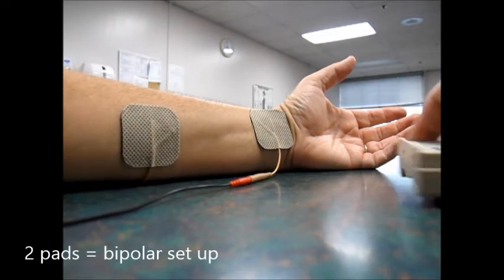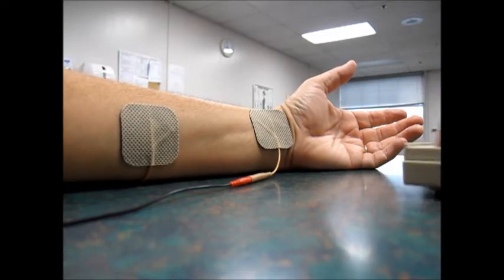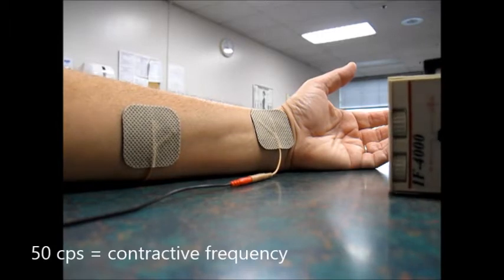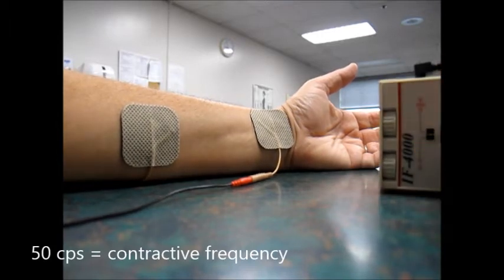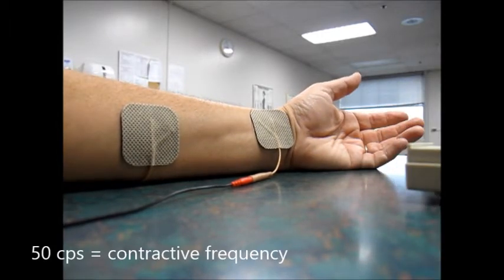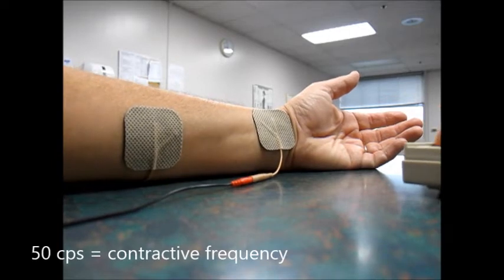It's set right now to a frequency of 50 to cause contraction, and the dials are set so that it's set up for bipolar and on continuous, so I'm going to turn it on and off, and you'll be able to see the difference between the two.